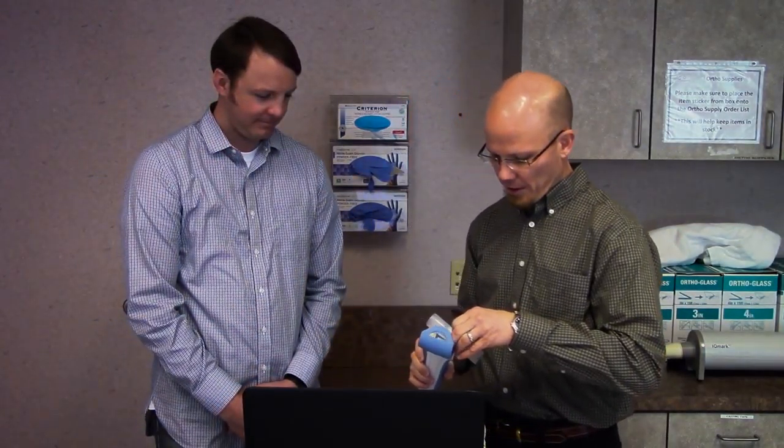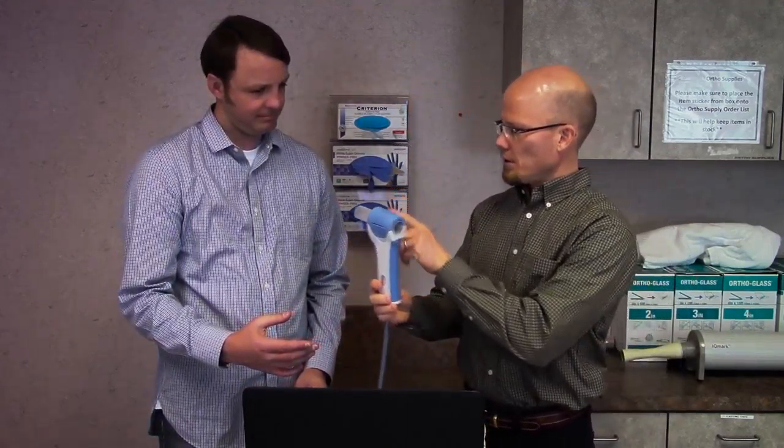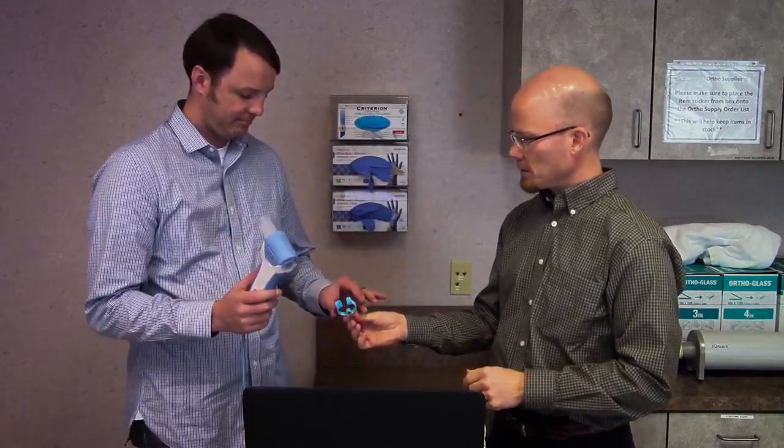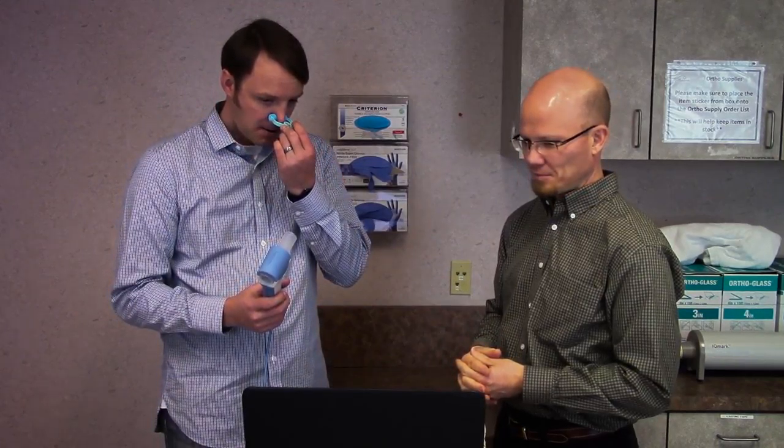This is our handheld spirometer. We have a new mouthpiece for you that we're going to put in now that we've calibrated our machine. You're going to hold it with the long end facing towards your mouth. And we're going to ask you to place this on your nose so you're only breathing through your mouth. Go ahead and put that on.